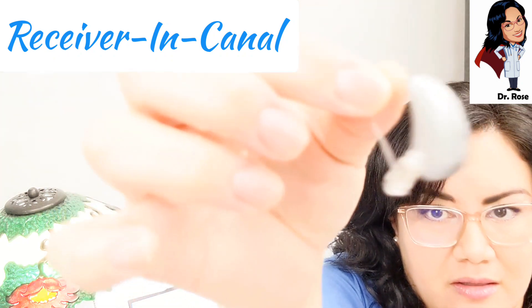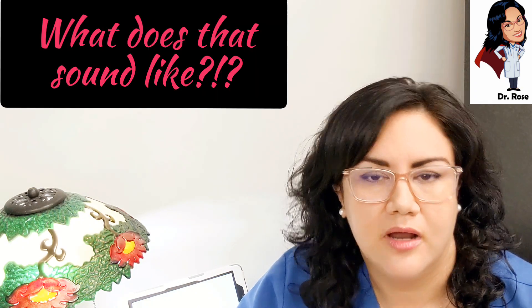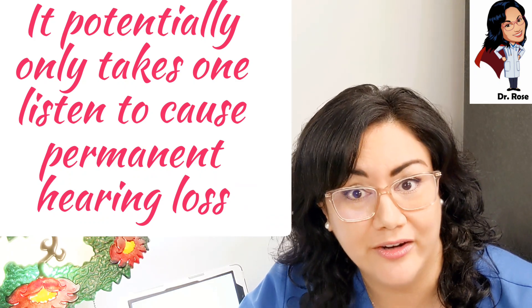If I had to pick, it would be the receiver-in-canal style. But with that aside, you also want to be careful where you're finding these hearing aids. If someone gifts one to you, get a professional's opinion, have your hearing tested, and see if it's a good match. Also, there's a dangerous component to trying someone else's hearing aid — you could actually give yourself noise-induced hearing loss. Hearing aids can output sound pressure levels that cause instant damage to a normal-hearing ear.